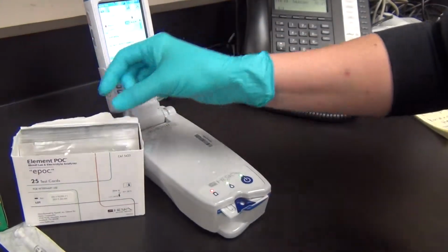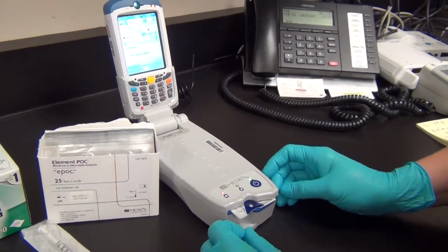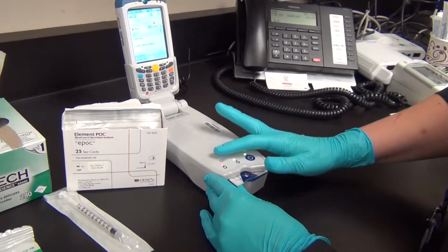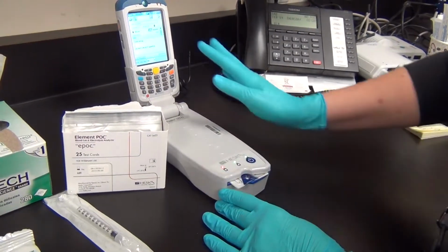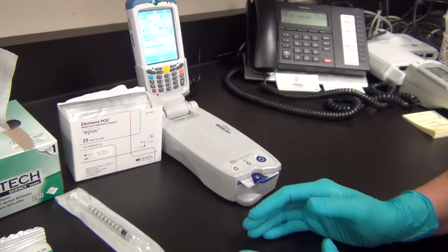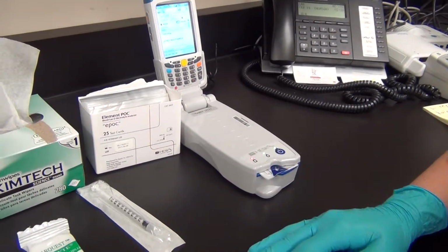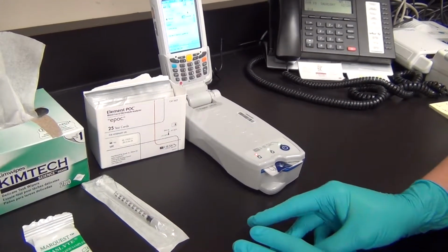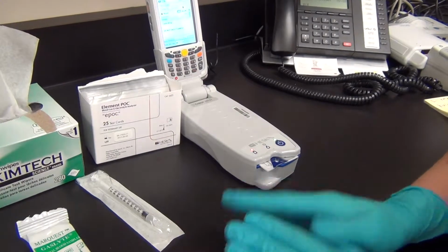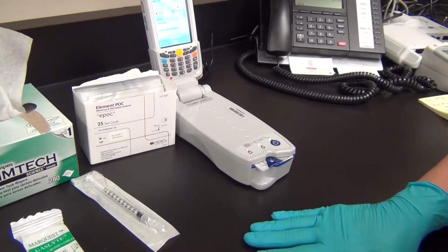If you have a barcode reading error, you can remove the cartridge and reload it, smoother and probably faster, to enable the barcode reader. If you have a calibration error, those cartridges cannot be used again and need to be thrown away and a new cartridge opened. Once the cartridge is loaded, we have 3 minutes for calibration to occur before the cartridge is ready for any sample.